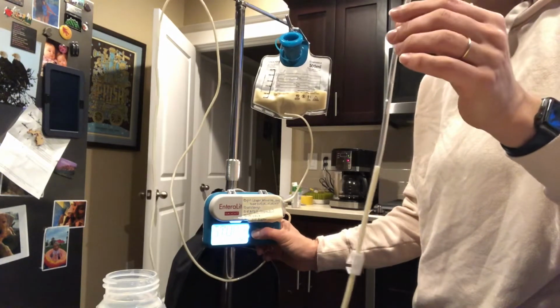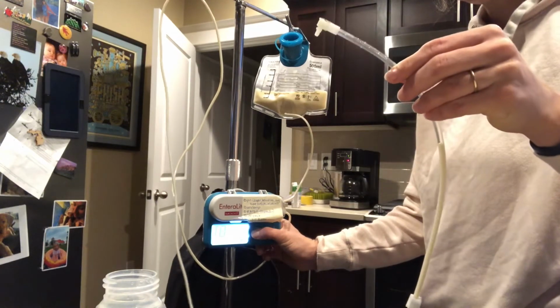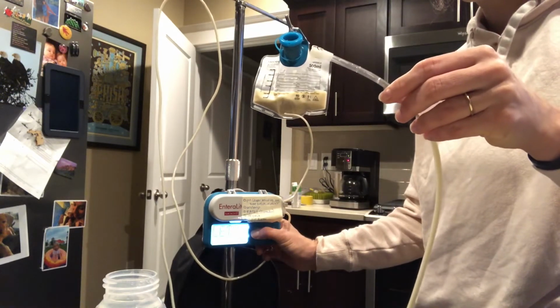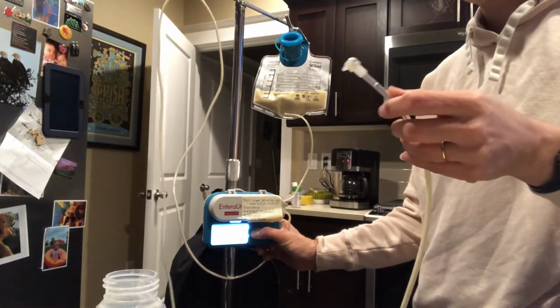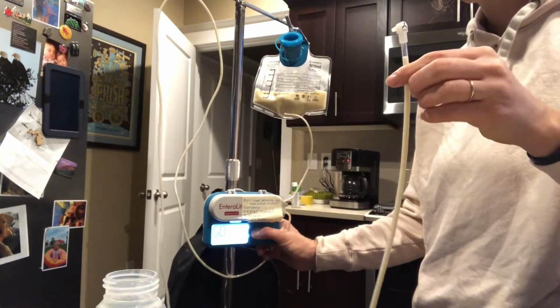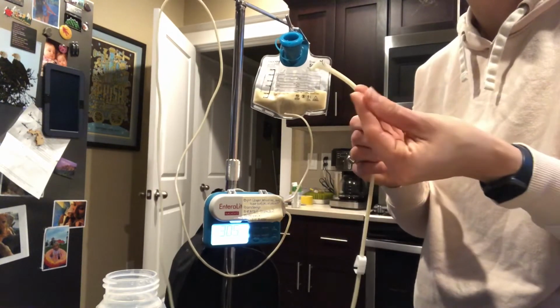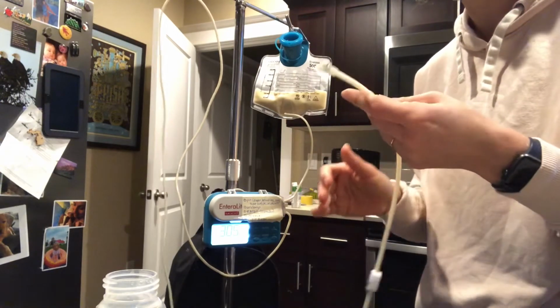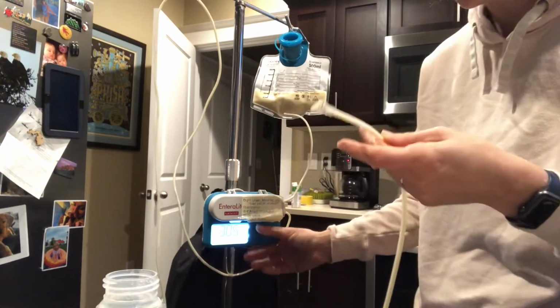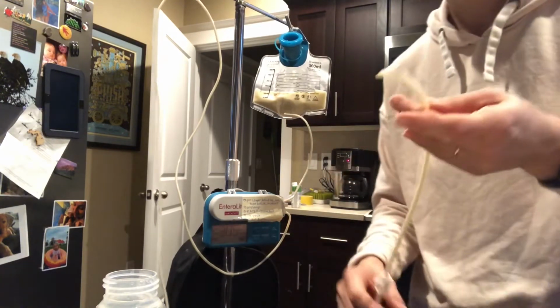So as you can see, the milk is slowly, very slowly, getting to the end of the tube, and I'll just kind of show you how we let it go all the way to the end. And so we actually do it until a drop comes out, you see the liquid came out. So it's all the way to the end there. And then it's time to hook her up.